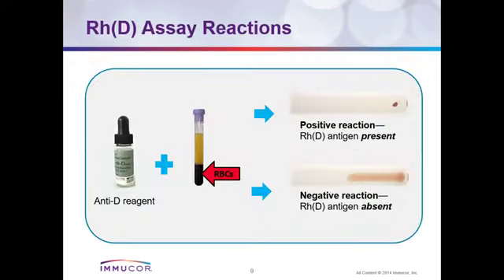So how is it done anyway? You have your anti-D reagent, which is commercially prepared, and then you have your purple top sample. You first centrifuge the sample and then remove your plasma, unless you're doing indirect or reverse. But if you're just doing your direct, you remove your plasma, wash the cells, and then make your 5% red cells, or the 25% red cell suspension if you're using the tile, and then you mix with your anti-D and you get your results.